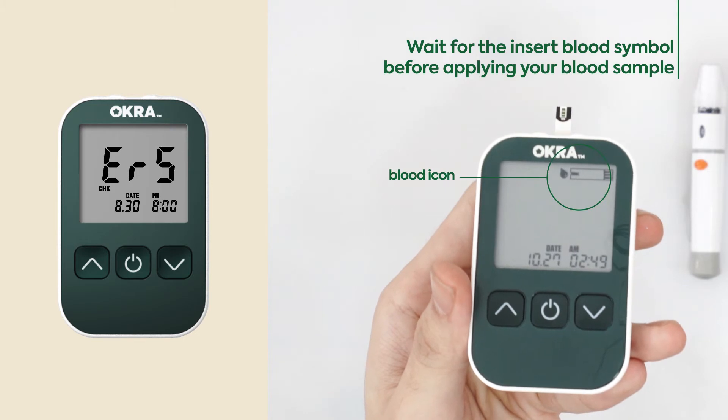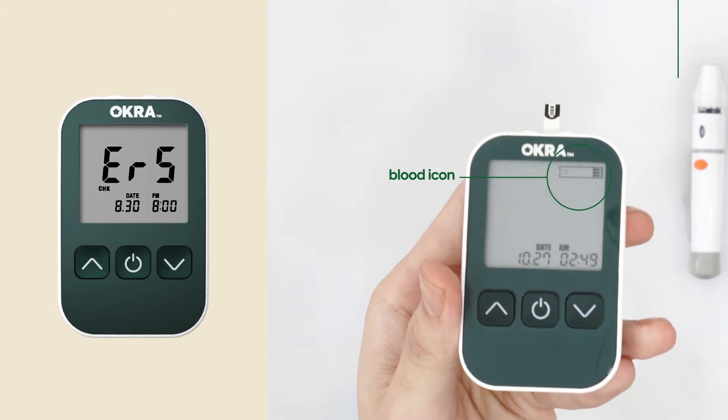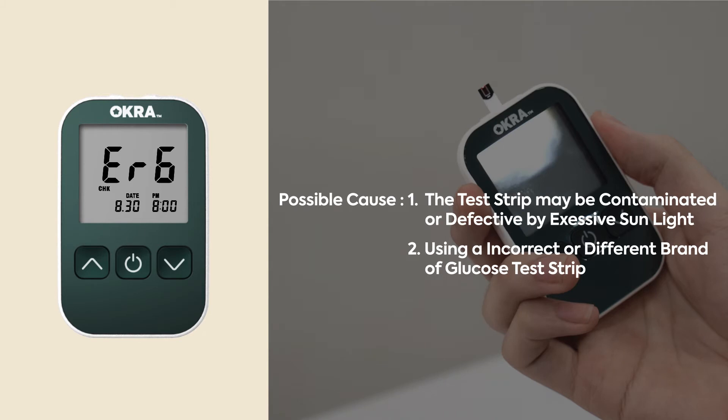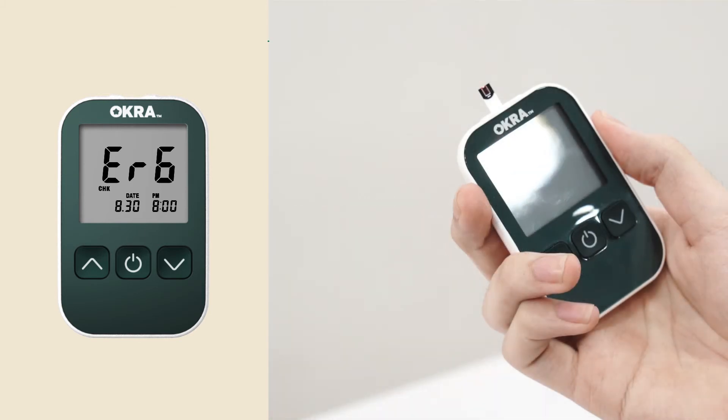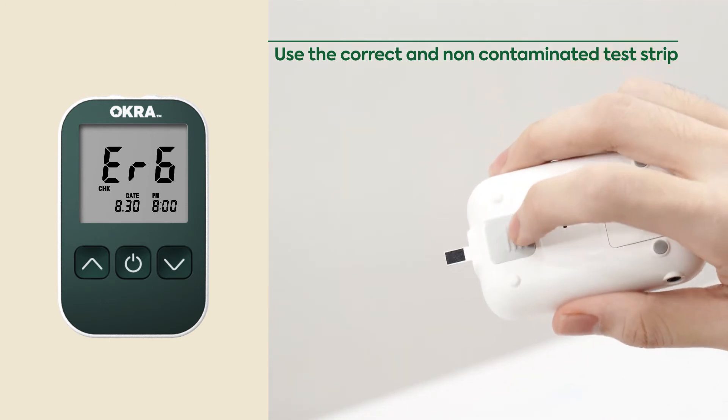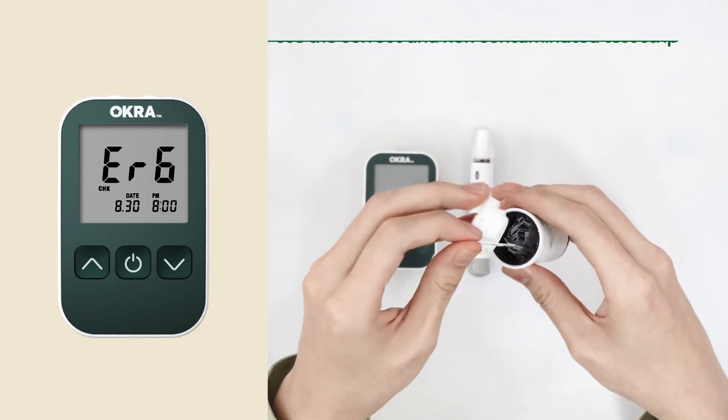Please insert a new glucose test strip and perform your test again. Please wait for the insert blood symbol before applying your blood sample. Please use the correct and non-contaminated test strip. If the error persists, please contact customer support.